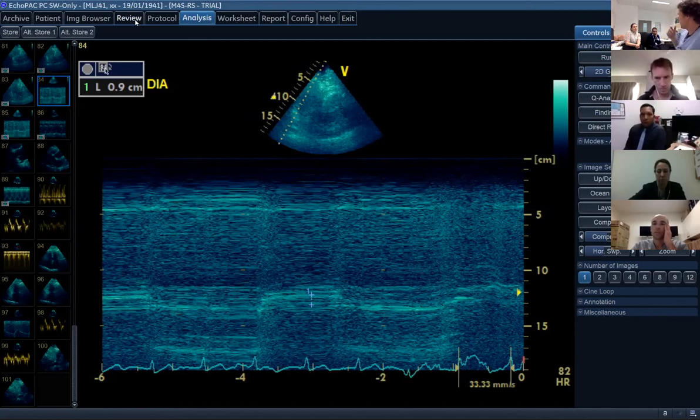Thank you. Sorry, Louise asked, I was asking a question. So the question was, what position do I do the diaphragm thickening in? I normally sit them up at about 45 degrees. I go to the anterior axillary line, and I try and go perpendicular to the ribs with the linear probe. If I can't find it, I slide backwards or go upper rib. You're looking for obvious thickening of the diaphragm, two bright white lines.